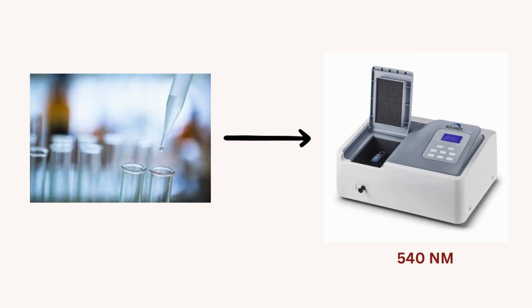Label two additional tubes for each patient and control with a name and total label. So this represents the total hemoglobin. Next, pipette 5 ml of distilled water into each of the tubes labeled total. Add 0.02 ml of the appropriate hemolysate to each test tube labeled total. Label another set of tubes into which the hemoglobin F tubes will be filtered.